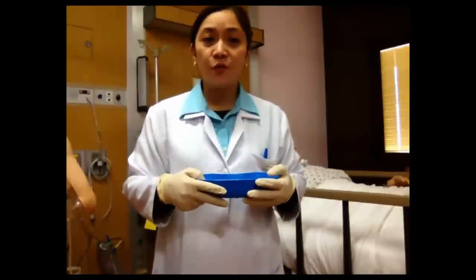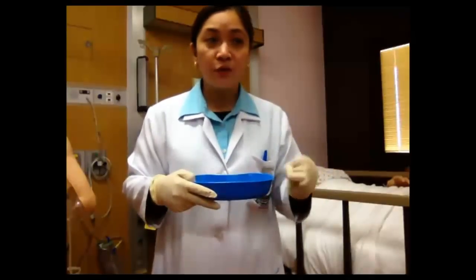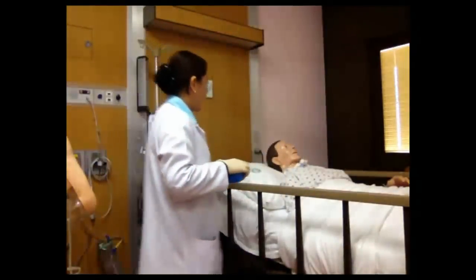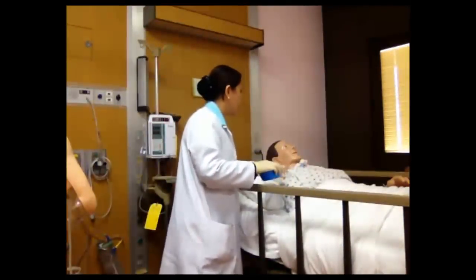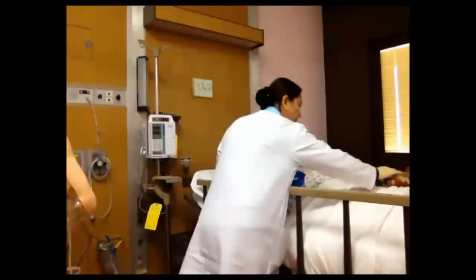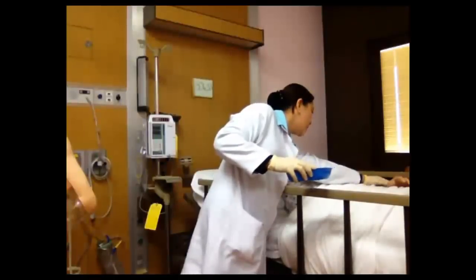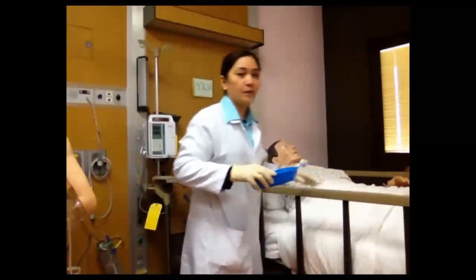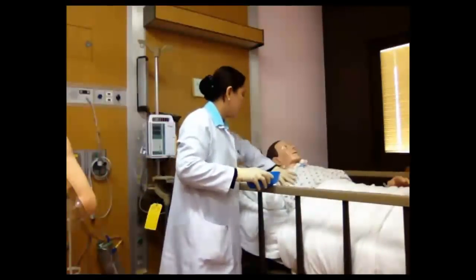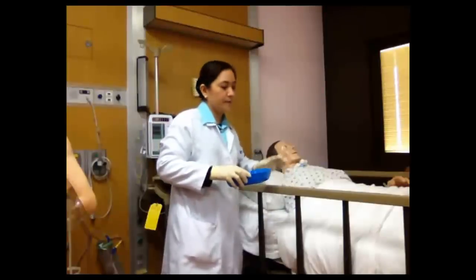Of course, we have to identify our patients correctly, explain the procedure, and provide privacy to our patient. Good morning, sister. What is your name? She said, I'm Aisha. Okay, Aisha, can I check your identity band? Okay, this is Aisha Ali Al-Shamari. Aisha, I'm going to give you an injection here on your arm. And then she said, okay.